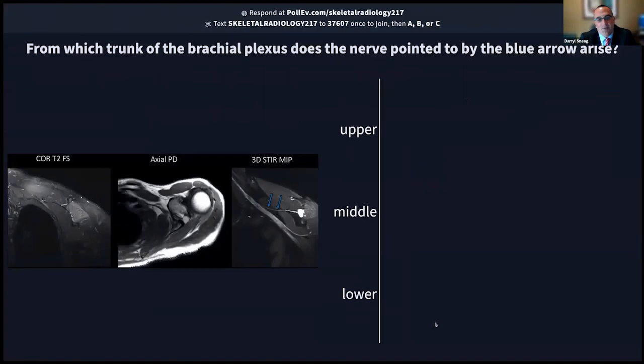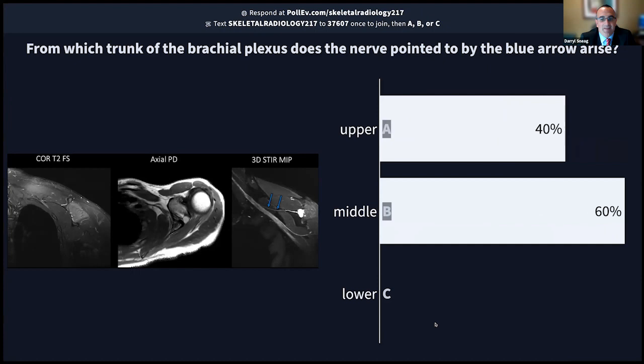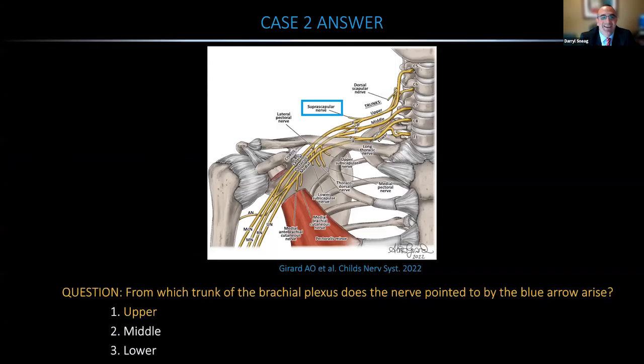So let's go to the answer poll. And we see some back and forth. All right. So we're about 50-50, 40-60, upper, middle. No one lower. And it keeps changing. Okay. So the correct answer is the upper trunk.